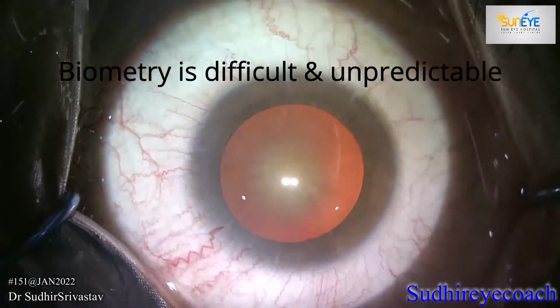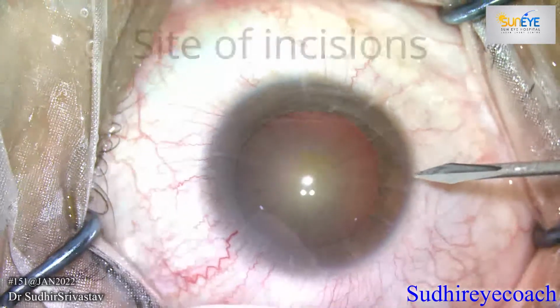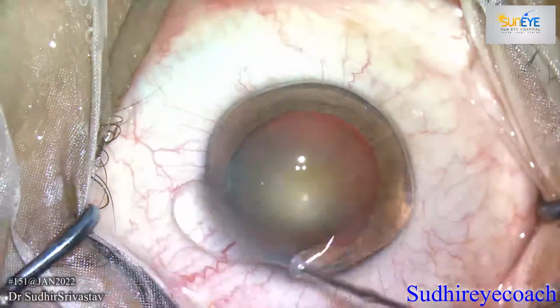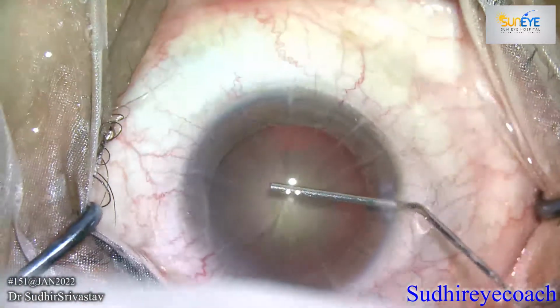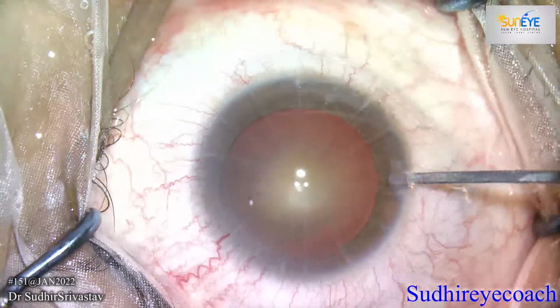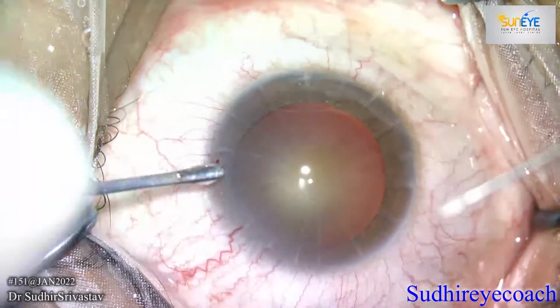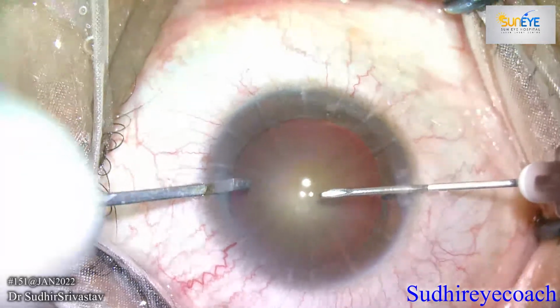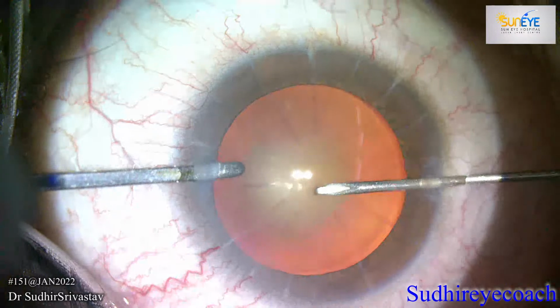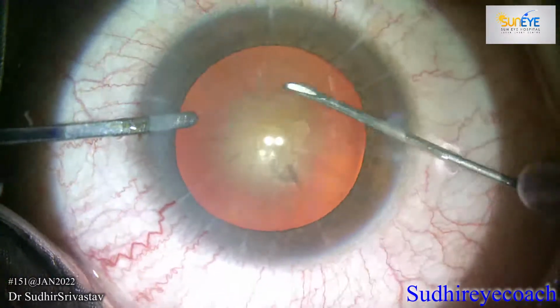Today I'll be sharing an interesting video of how radial keratotomy affects phacoemulsification. First thing, during surgery we have to be cautious about the selection of the site of incisions. We have to avoid previous scarred incisions. Luckily in this case the incisions were apart, so I selected two side port incision sites which were quite apart from the previous incisions. I created a decent sized capsulorhexis of around 5.5 millimeter.